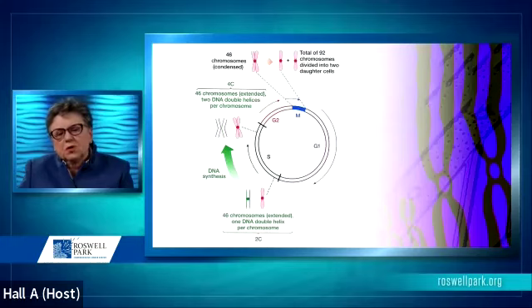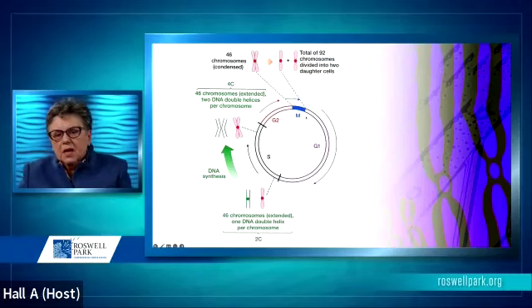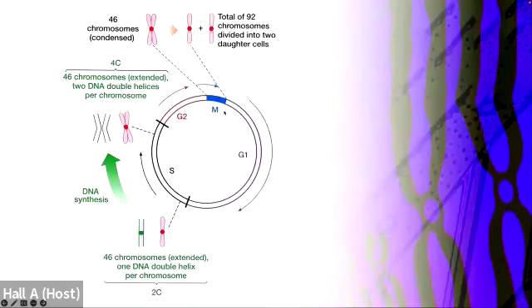So let's review how chromosome analysis actually is performed. Many molecular biologists and pathologists are unaware that you have to have a source of dividing cells in order to visualize chromosomes. And this is important because we are always interested in the mitotic stage of the cell cycle, which normally would take about 1 to 2 hours. It's a pretty small window of opportunity for us.